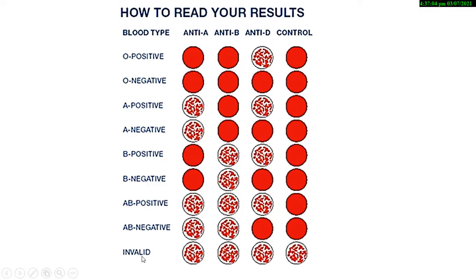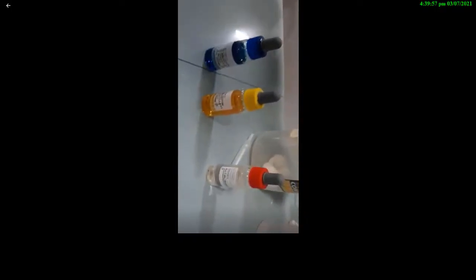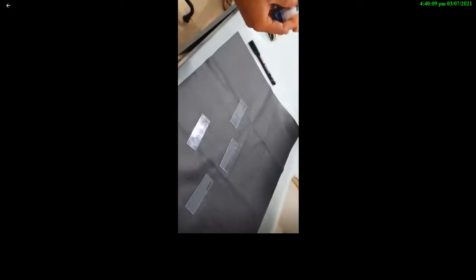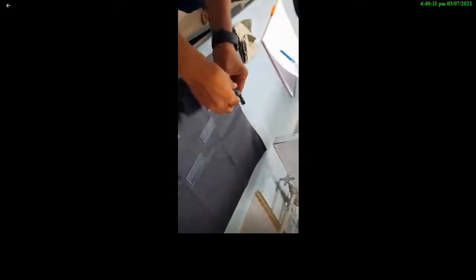Now we will see how to measure blood group practically. We require anti-serum A, anti-serum B, and anti-serum D. First of all, we have to mark the slides. There are generally four slides which we have already marked as A, B, D, and control sample.